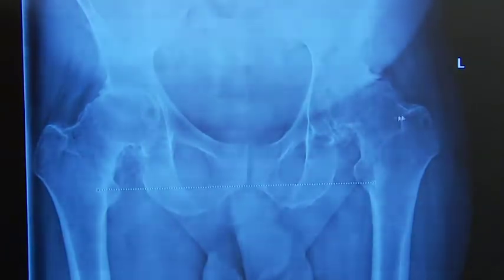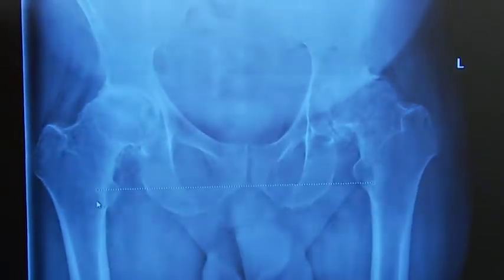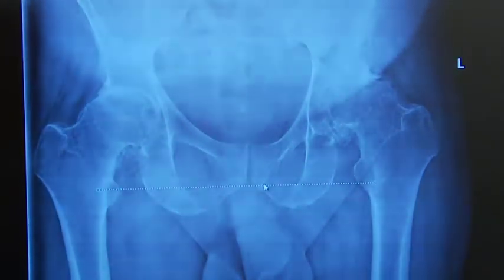But I know if I'm going to do them in stage fashion, I would do his left first, and I would try to lengthen his left more than the right so that when I come back to do the right, I have the ability to lengthen that right one to compensate for this severe arthritic degeneration. So those are things I see.